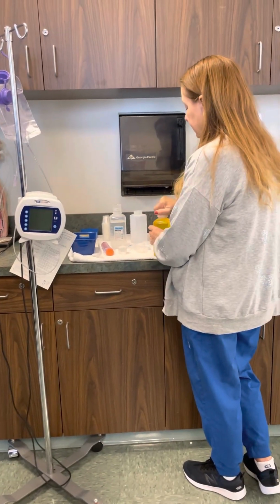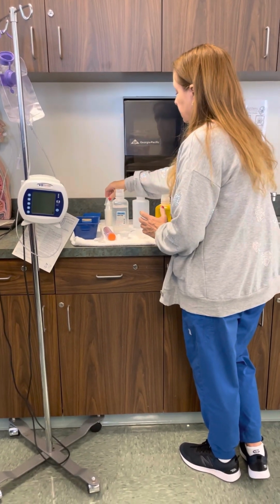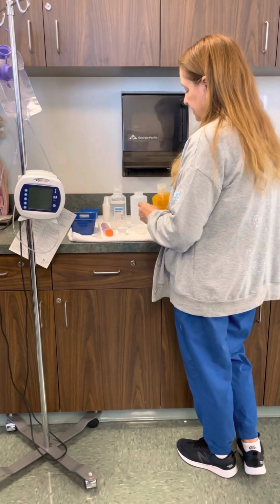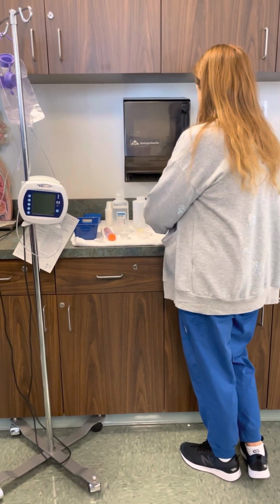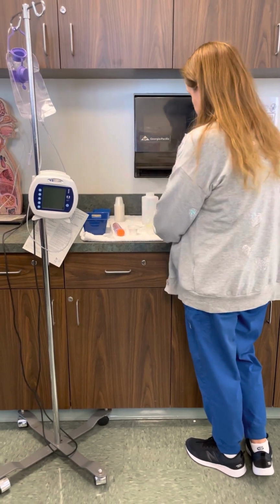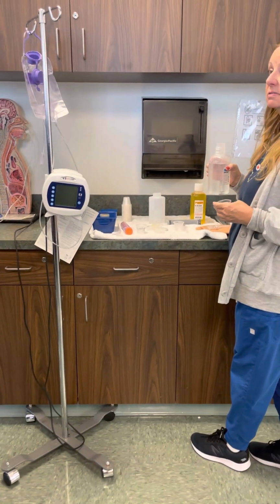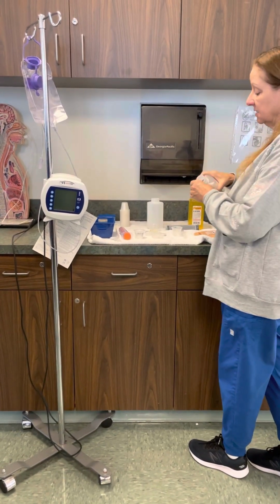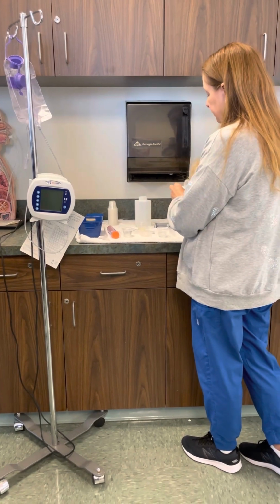Then let's say I'm giving a liquid medication, and let's say I'm giving 10. You always want to wear gloves while you're doing this. And then how much am I going to flush in between medications? 15 to 30. 15, and then I'm going to finish off with at least 30.